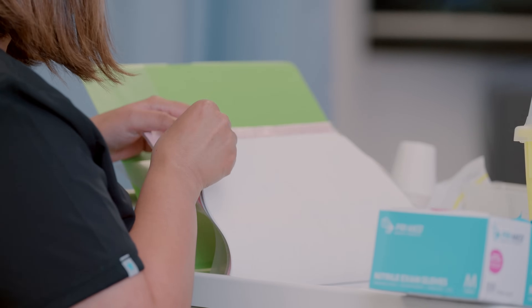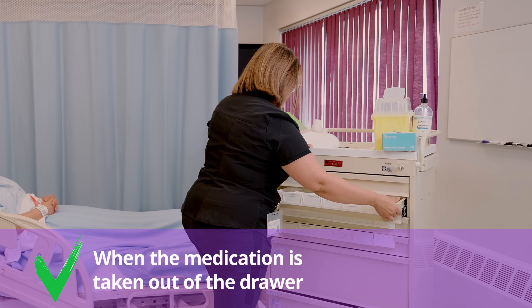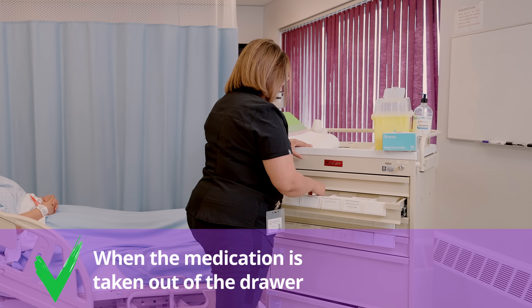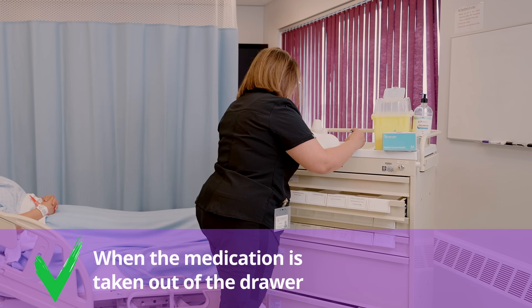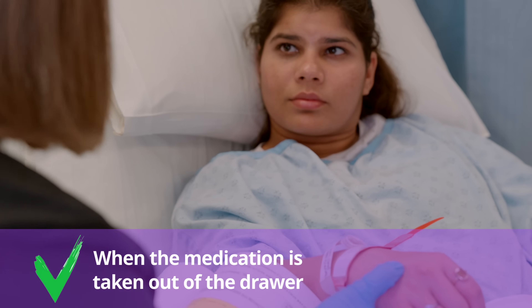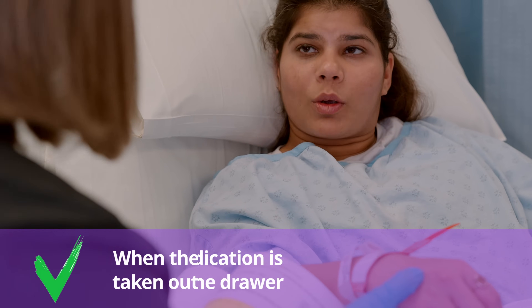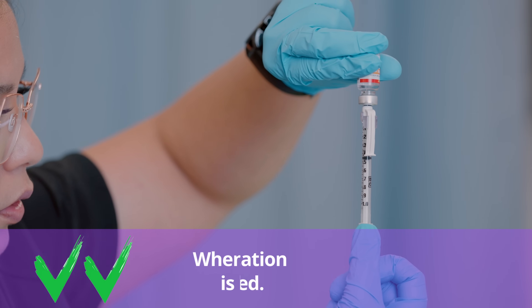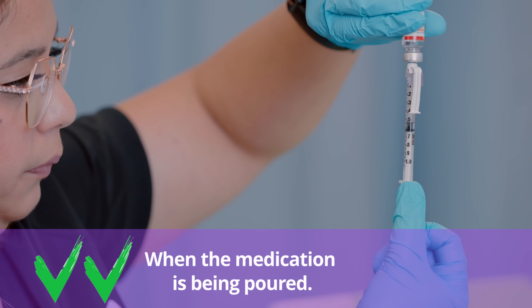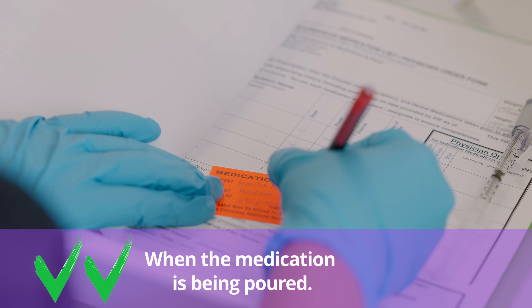Let's learn about those medication checks. Check number one: when you read the MAR and remove the medication from the drawer and identify the patient's name, room number, date of birth, etc. Check number two: while preparing the medication, confirming the medication label matches the MAR.